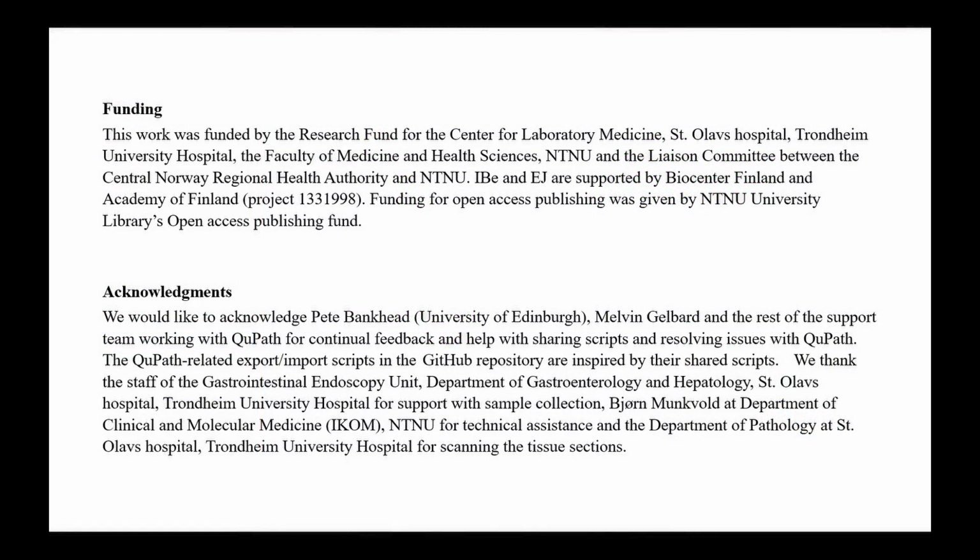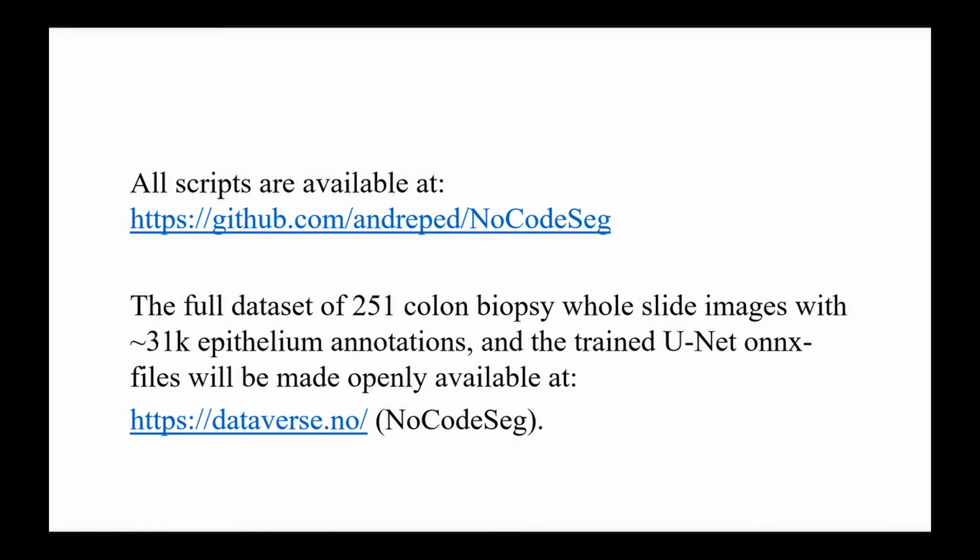This work is a collaboration between St. Olavs Hospital, the Norwegian University of Science and Technology, University of Helsinki, and SINTEF. All the scripts used in this study and the tutorial are available at GitHub, no-code-seg. The full data set of 251 colon biopsies, whole slide images with 31,000 epithelial annotations, and the trained UNets will be made openly available at dataverse.no, no-code-seg. Thank you.